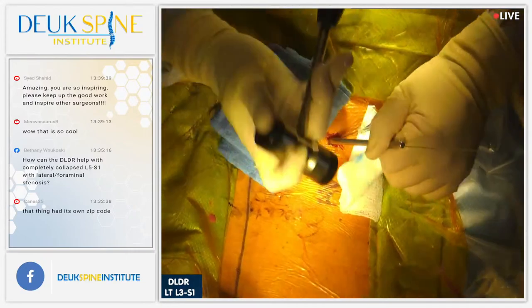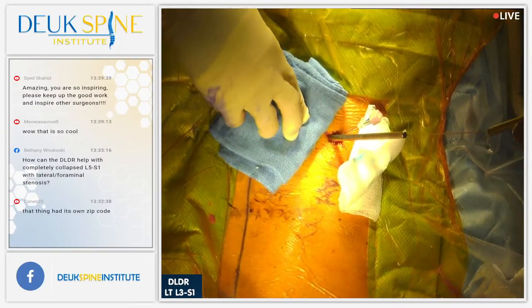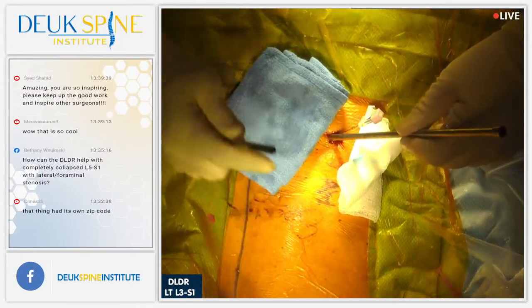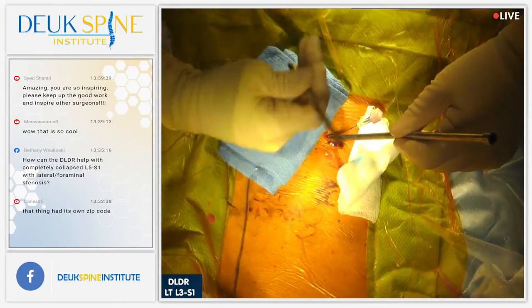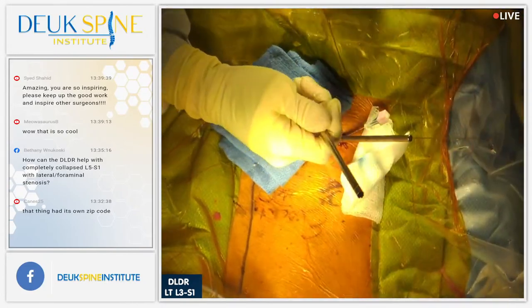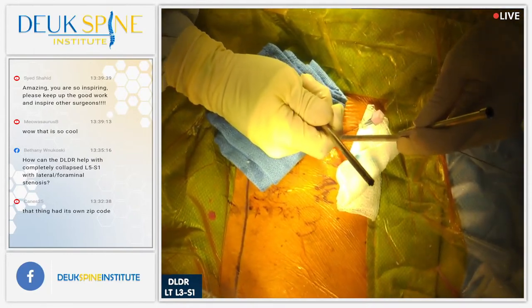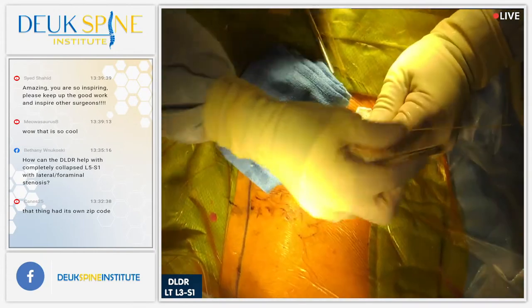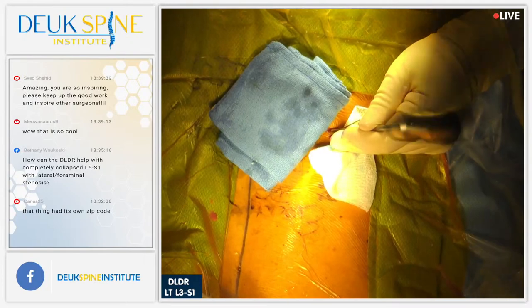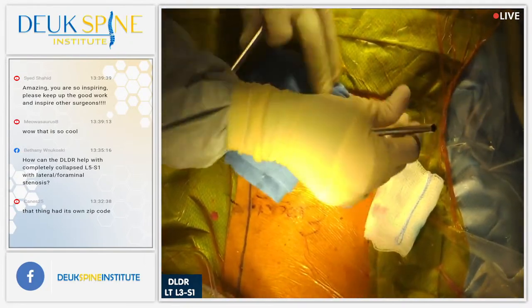Shot? All hands on deck. Shot. Pull back the guide wire a little bit. Shot. Pull back, pull out the guide wire. Go.